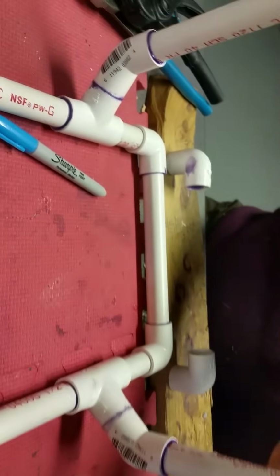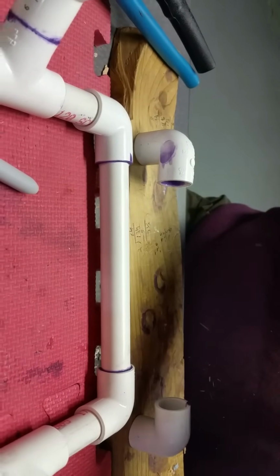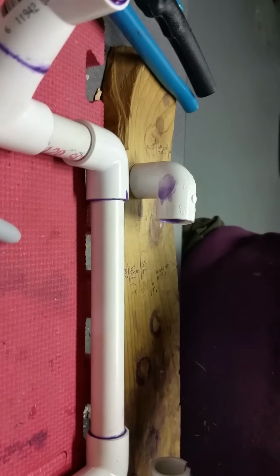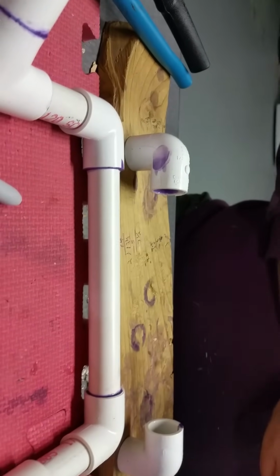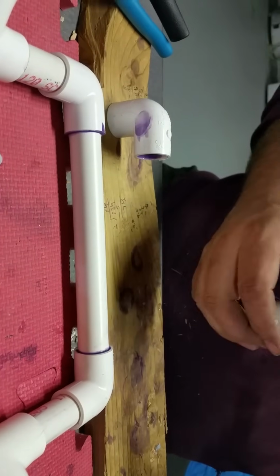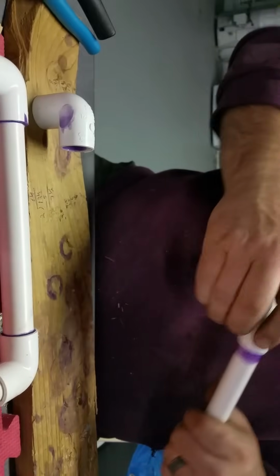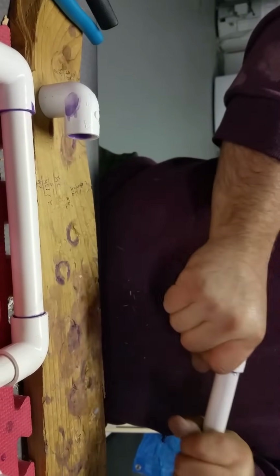When I primed these two 90-degree pieces, I got a little bit sloppy and it dripped. You can see my fingerprint there. It's a good time to remind you that this primer stains and it will not come out of clothes no matter what. So you want to wear some knockabout clothes when you're working on this because you could ruin what you're wearing.